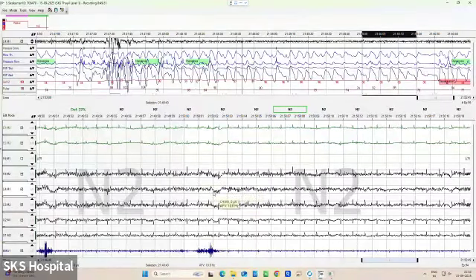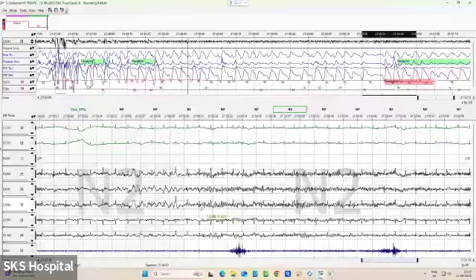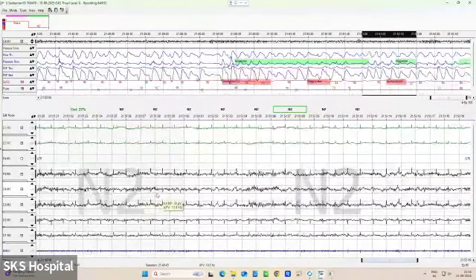So as you can see here, these are all slow waves. This is an alpha wave and this is a slow wave. Slow wave means in this 1 second window you can see one, two, or three peaks of waves, which means the frequency is only three, which becomes a slow wave. Whereas here it's an alpha wave where you can see many such waves, with a frequency of more than 8 to 10, which becomes an alpha wave. So slowly the patient is transitioning into sleep now.